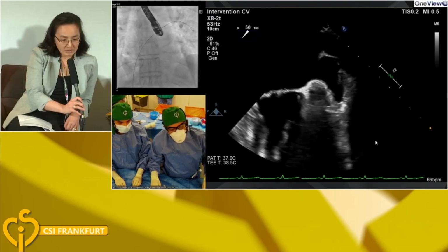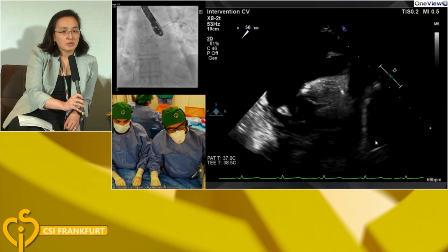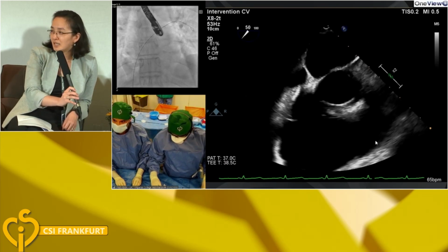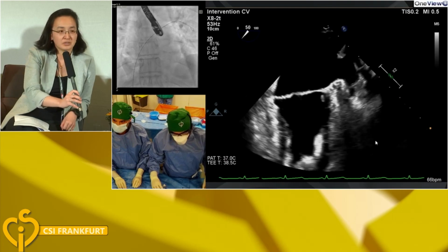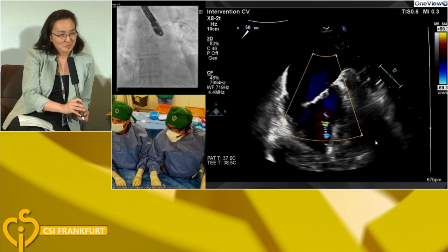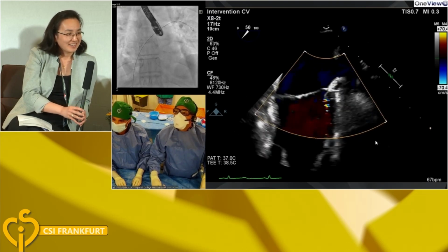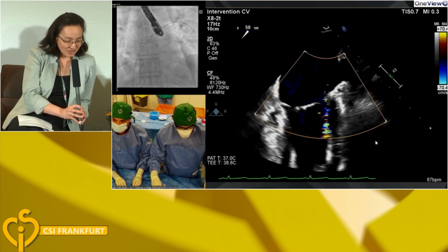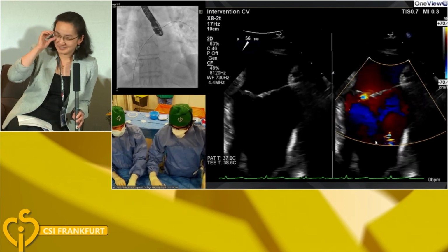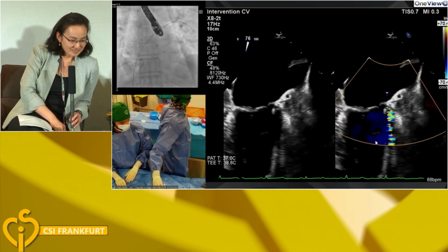Hey, Bushra, how does a mitral valve look? Is there any MR on this patient? Yeah. Because one of the things at our institution that we worry about is we can close any PFO and we can close any ASD, but which one can we burn across in 5 years if they have mitral valve disease? Yeah, the mitral valve is normal here, just to show you a picture, but... Darn. Bushra, what size did you get on balloon? I got 11, 12 millimeters, yeah.